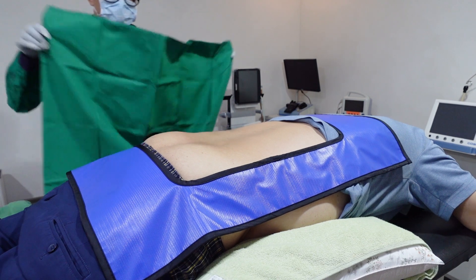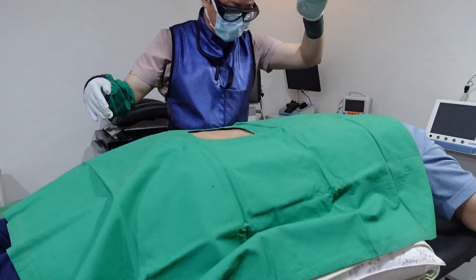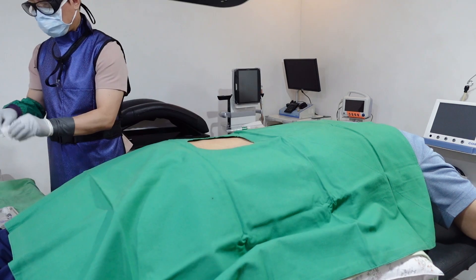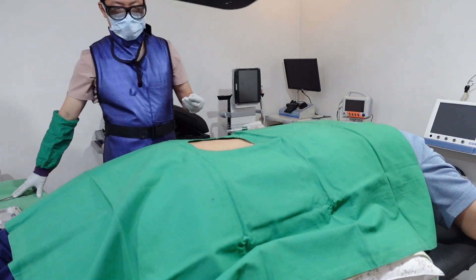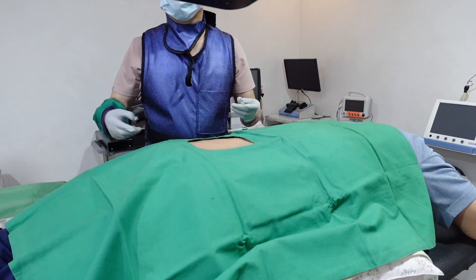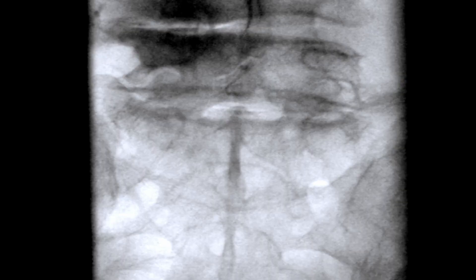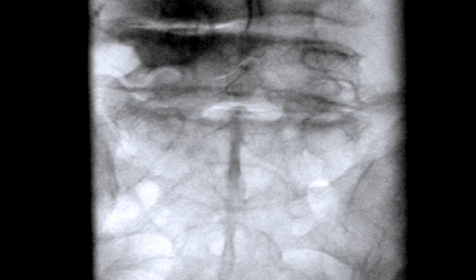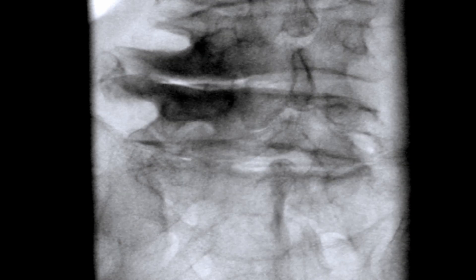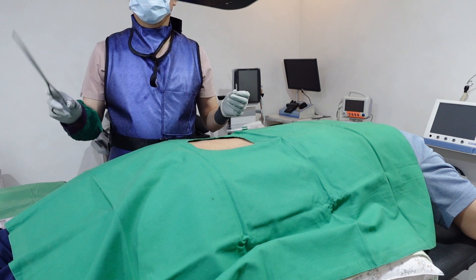The patient underwent a transforaminal injection utilizing a left L5 subradicular approach, supplemented with L4-5 flavo injections. A step-by-step video demonstration of the process is provided for your detailed understanding. Our team meticulously adjusts the C-arm throughout the procedure, modulating its rotation and tilt to yield clear, stepwise images from needle manipulation to the actual injection.